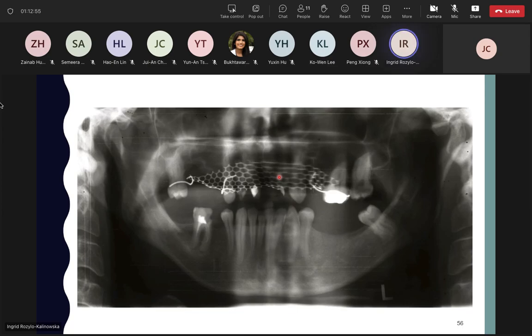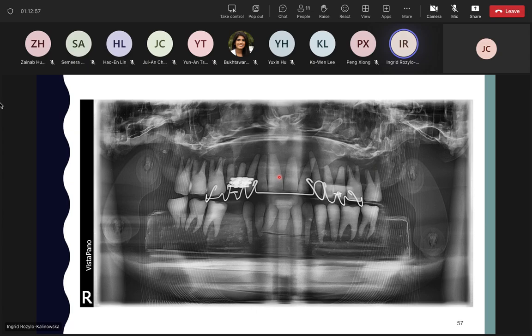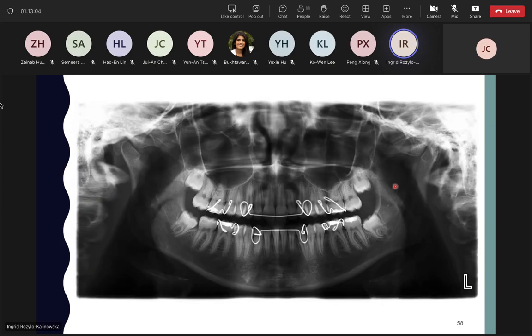This is a removable orthodontic appliance. I took this picture in our phantom, but it's quite surprising that I also could find a panoramic, and not with a single, but with two orthodontic appliances. So this was clearly a mistake of a radiographer.